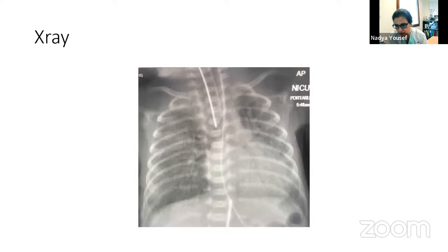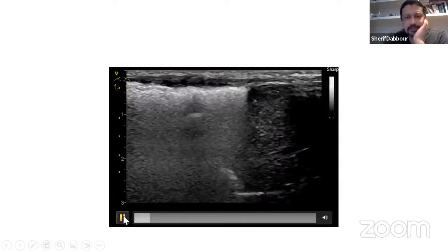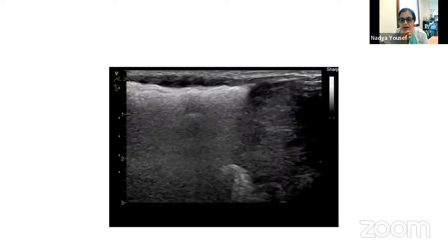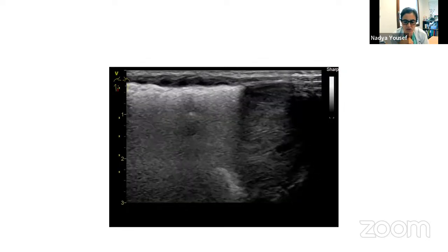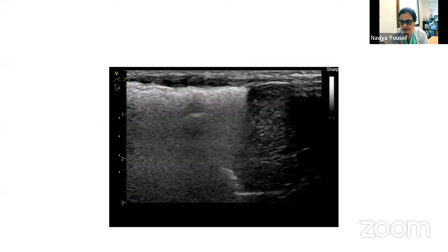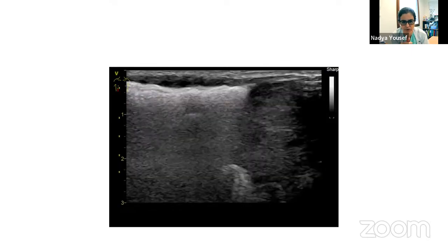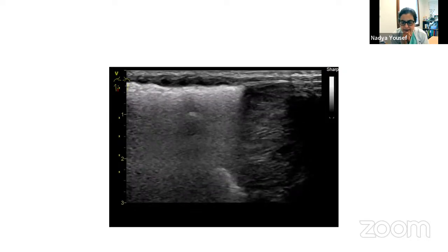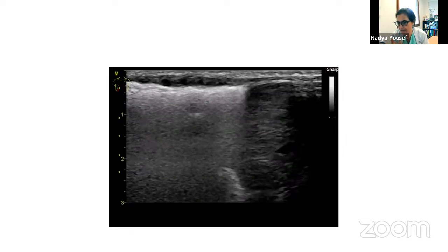So what would you expect to see on the ultrasound scan? Going back to the image where you asked, could this be compatible with PIE? Well, bronchograms. Well, I don't know. I totally agree that this occurs in bad lungs, with chronic disease changes, where you would have areas that are non-aerated, definitely. You would have areas with B lines, for sure. You would have a thickened, irregular pleural line, yes. But in the area with emphysema, you would have areas where you would pick up air, right?